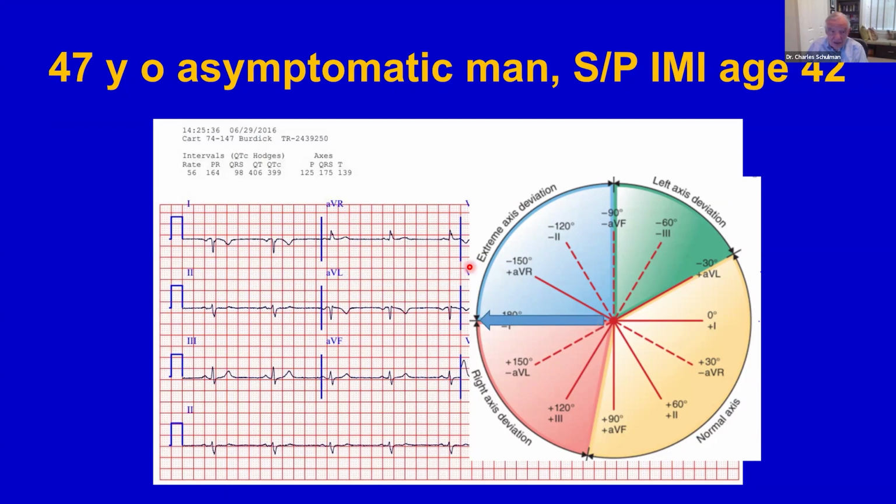What's going on here? Are there really Q waves in one and AVL? Did he have an old anterior infarction or lateral infarction sometime that we didn't know about?